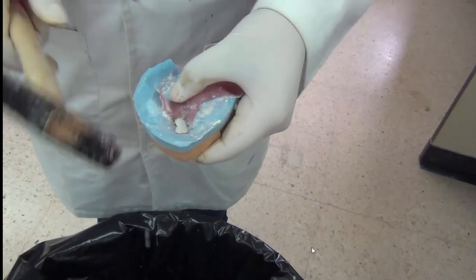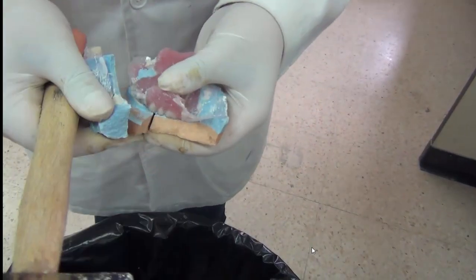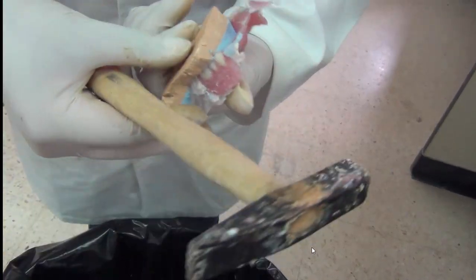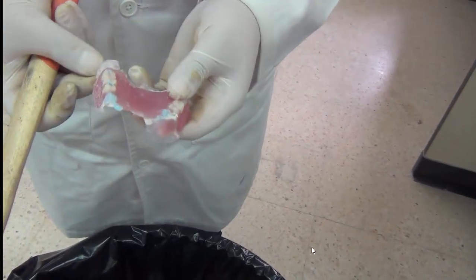It's preferred to have the vertical forces because they separate it from the denture better. Okay, and because it's separated well from the acrylic using the cold mold seal, you find that it easily separates from the denture, and now we have the full RPD in our hands without any separation.